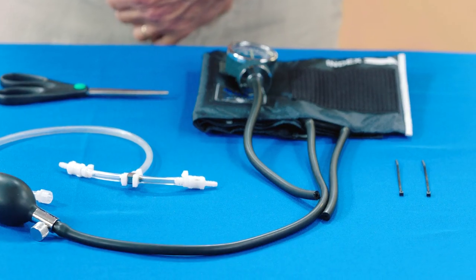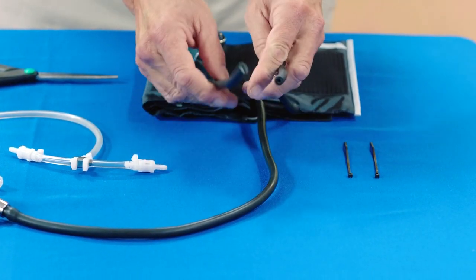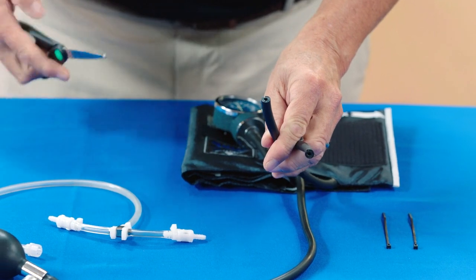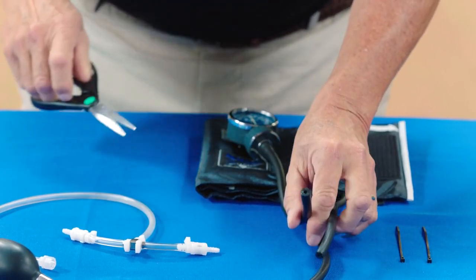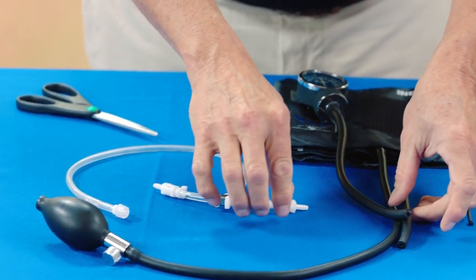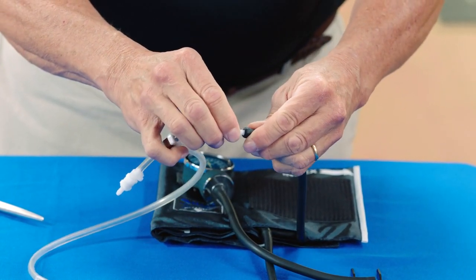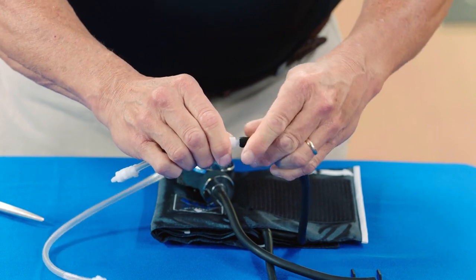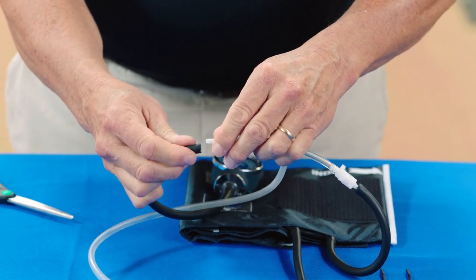You can take Juno's blood pressure using non-invasive monitoring techniques, but you will need to modify a standard blood pressure cuff. Cut the tubing attached to the gauge approximately 9 cm from the cuff. For the purpose of this video, we have already cut the tubing. Locate the barbed tubing connectors at the short ends of the T-shaped blood pressure adapter and insert into the cut ends of the blood pressure cuff tubes.